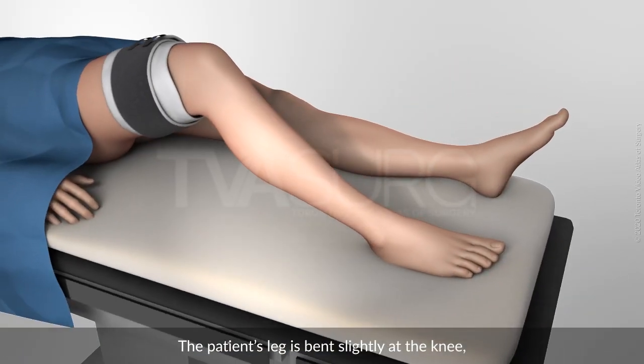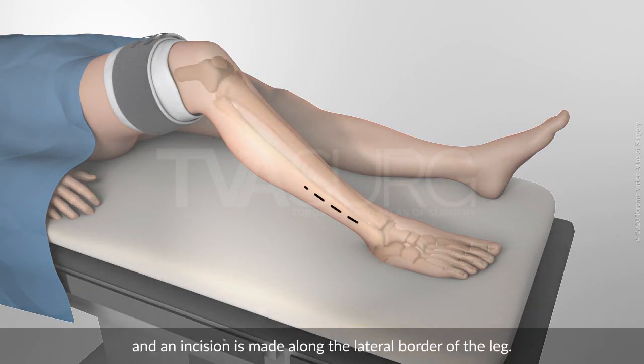The patient's leg is bent slightly at the knee, and an incision is made along the lateral border of the leg.